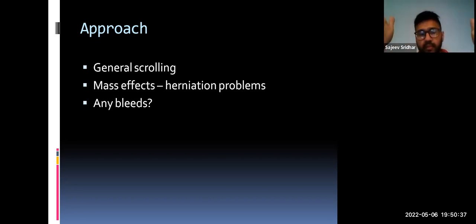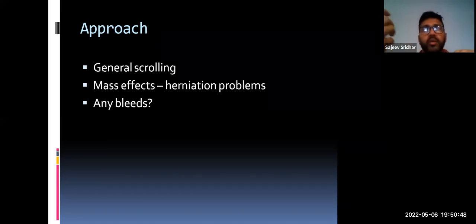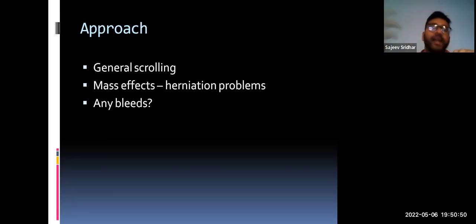Each of them has a variation in terms of how dense they are, and I'll get back to that later. Now, in general, the main thing you need to remember is that a hyperacute bleed does not look like an acute bleed that is clotting. An acute bleed will not look like a chronic bleed that has already clotted and is resolving by itself. And we will get to that as well.